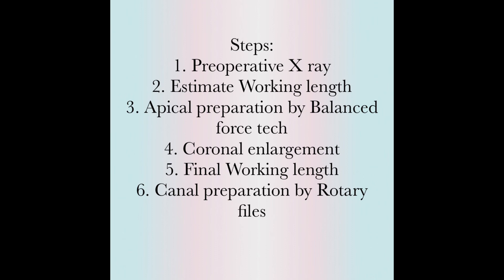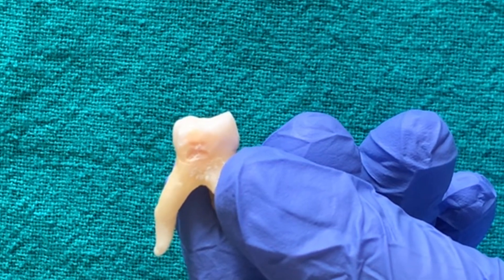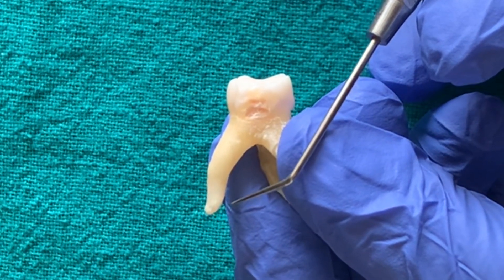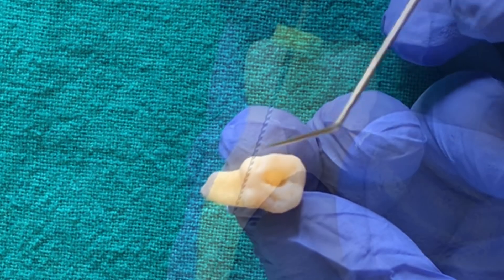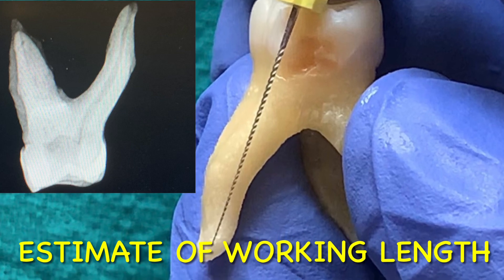This is an extracted maxillary molar. The palatal root has a double curvature — this is the point of first curvature and this is the second curvature. I'll be demonstrating how to prepare this curved root canal. The access cavity of the tooth is already made. The first step is to estimate the working length from the preoperative X-ray.